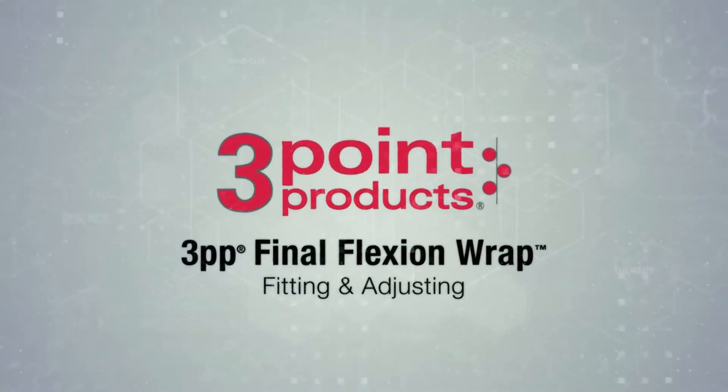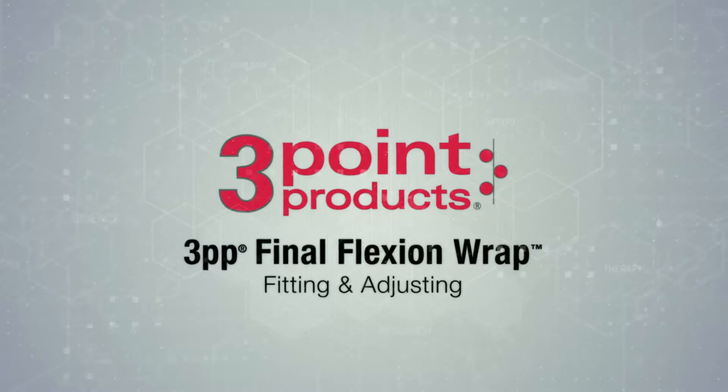In this video, we will learn how to fit the final flexion wrap to help you regain finger motion.